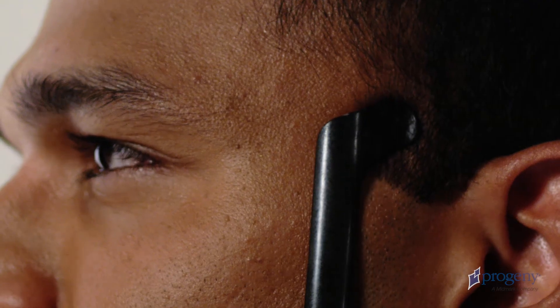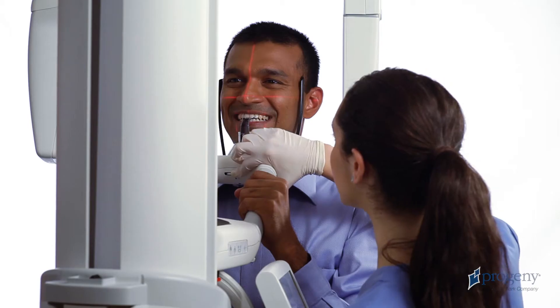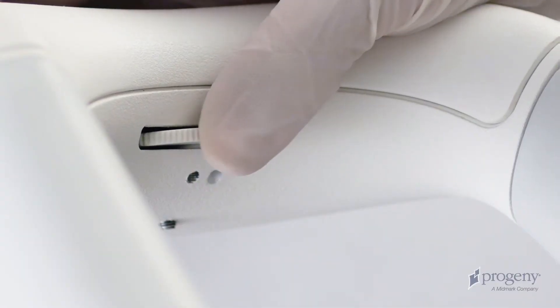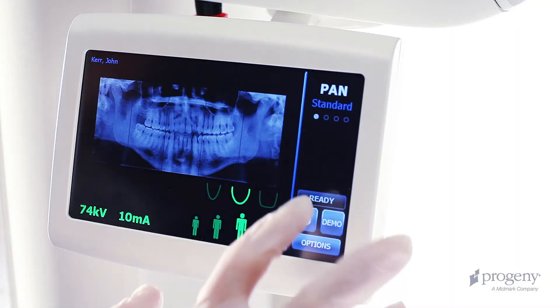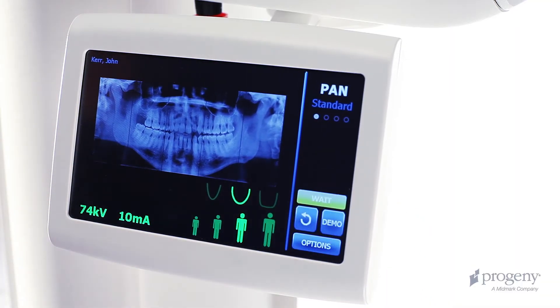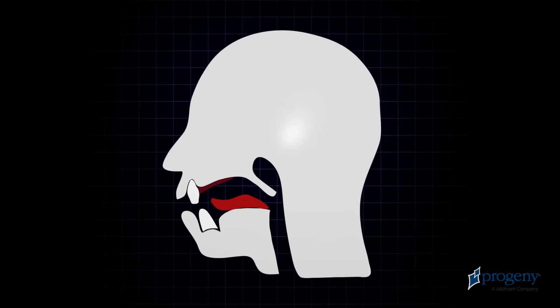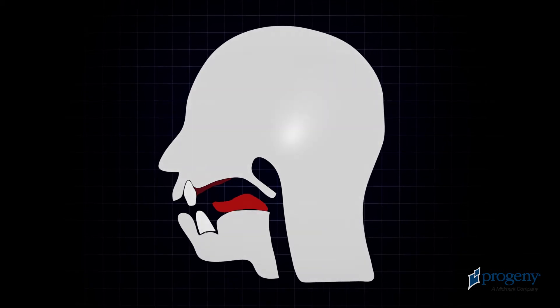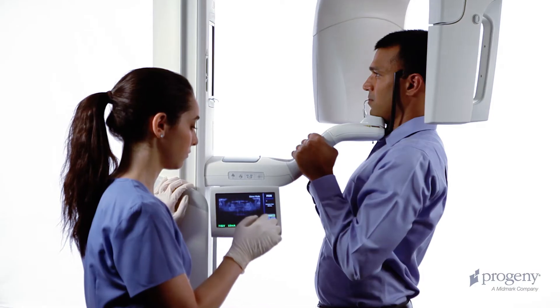Inform the patient to remain still. Ask the patient to smile and align the cuspid laser with the leading edge of the cuspid. Instruct the patient to close the lips around the bite piece. On the control panel, tap the cycle button once and verify the green ready condition. Instruct the patient to place the base of the tongue to the roof of the mouth as if swallowing.